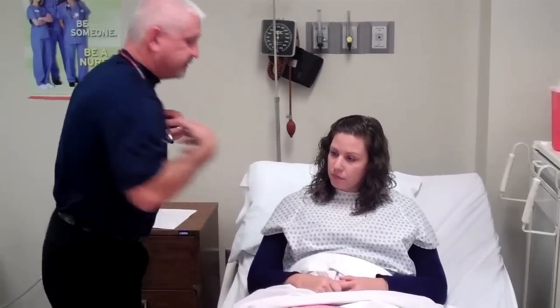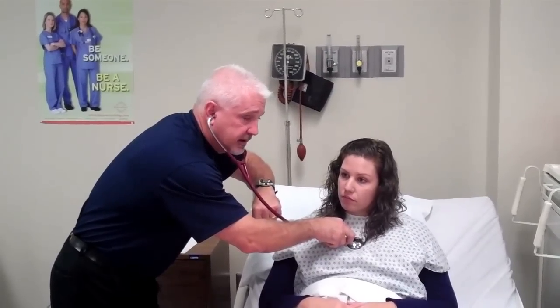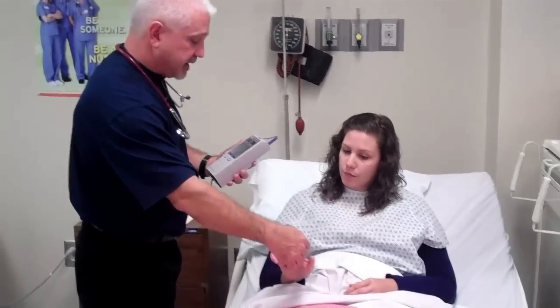At this point I'd check the patient's heart rate, respiratory rate, SpO2, color, and level of dyspnea. If I had difficulty obtaining heart rate or respiratory rate manually, I could use my stethoscope over her heart for heart rate, and over her trachea to hear air moving in and out for respiratory rate. I'd use a pulse oximeter — which measures the saturation of the hemoglobin molecule — placed on her finger to get her saturation.